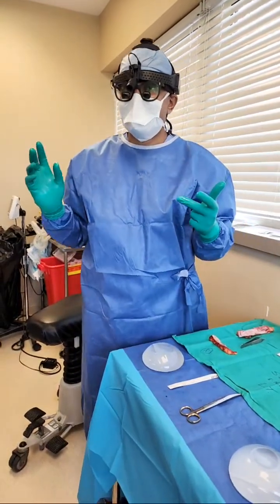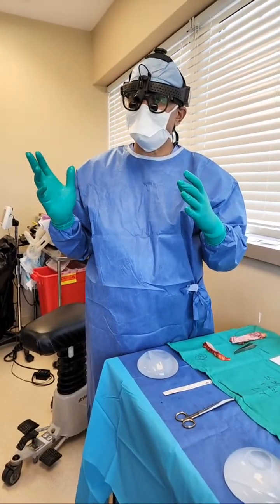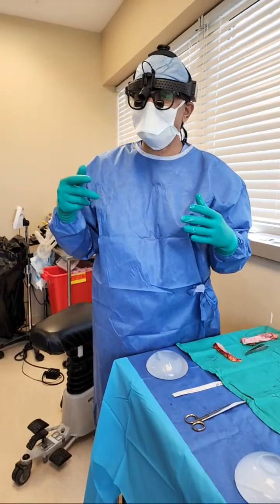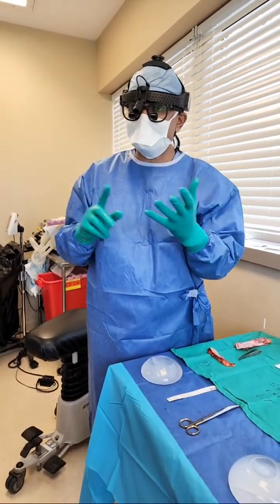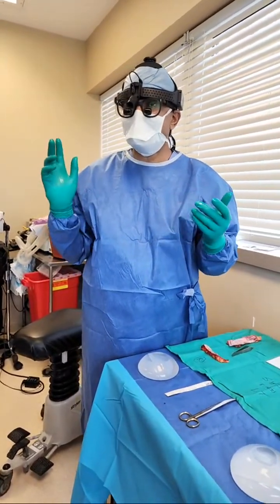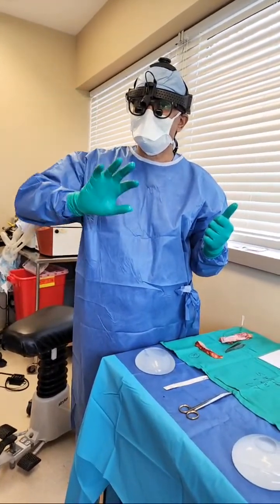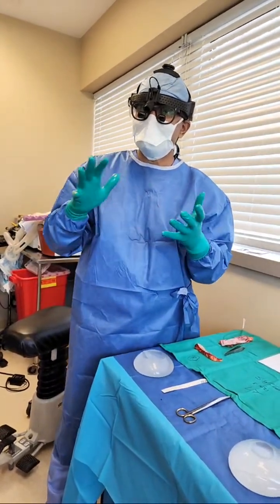And then the 8th point is all patients get the same surgery regardless of age. I did a 70-year-old patient right before her. She got the same surgery that this nice 24-year-old patient got, regardless of the extremes of age, comorbidities, or issues. The goal is simple: remove the entire implant capsule and all implant tissue, send it to pathology, and do it in the manner that I've done. And I've done so many of these persistently.